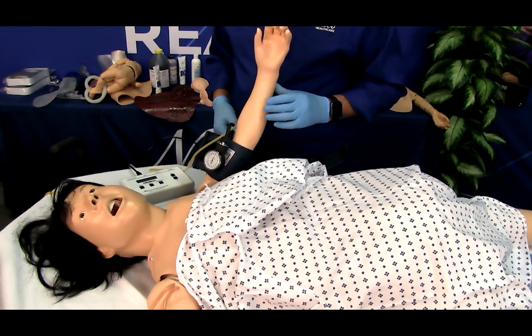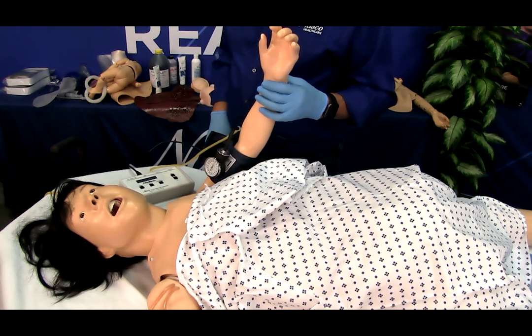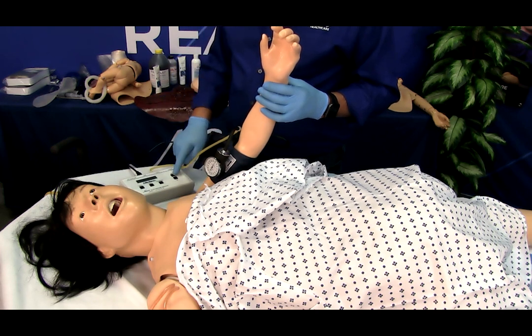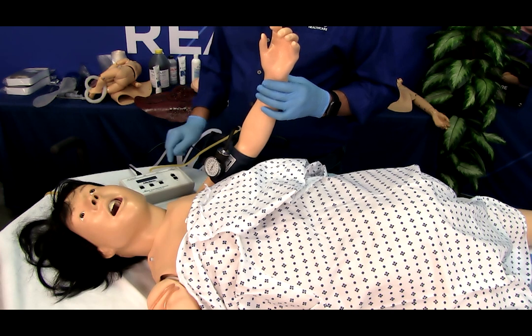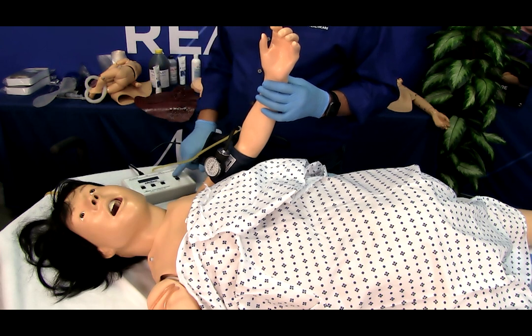To set the volume, the arrow keys control the volume of the sounds present in the arm. From the main menu, press the up arrow key to increase the volume or press the down arrow key to decrease the volume. The volume levels can be adjusted from level 1, lowest volume, to level 7, the highest volume.